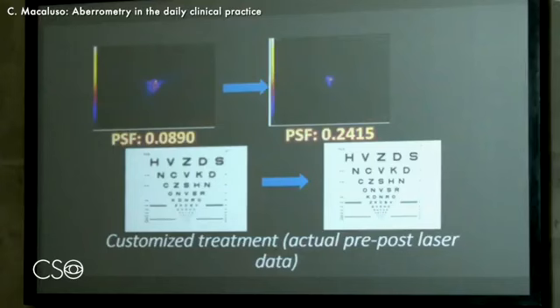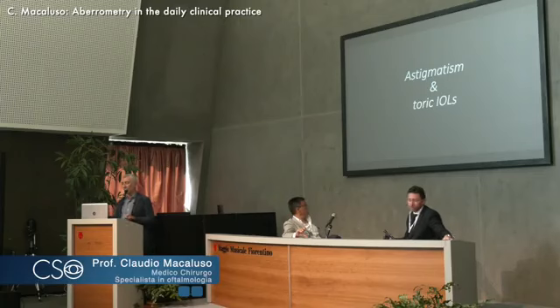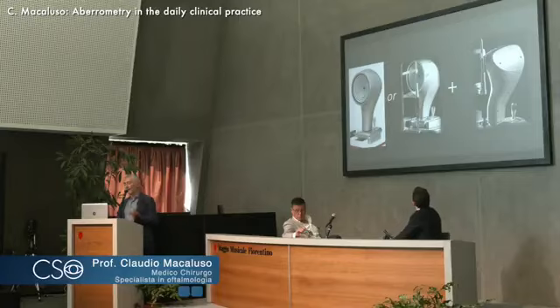And actually, this is the actual pre and post laser data. The improvement was there.